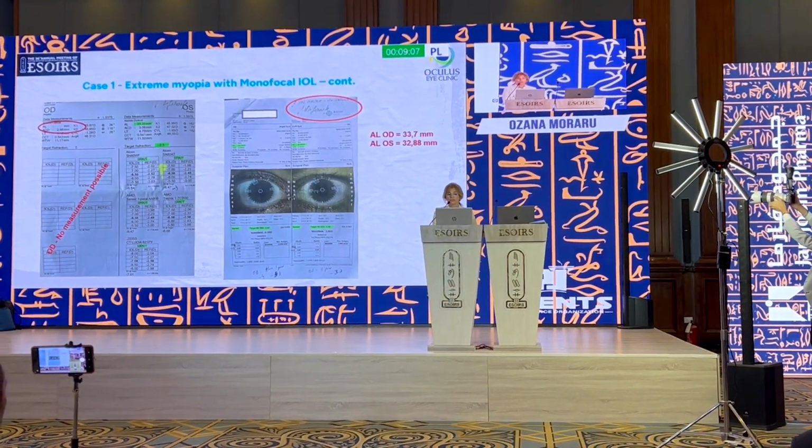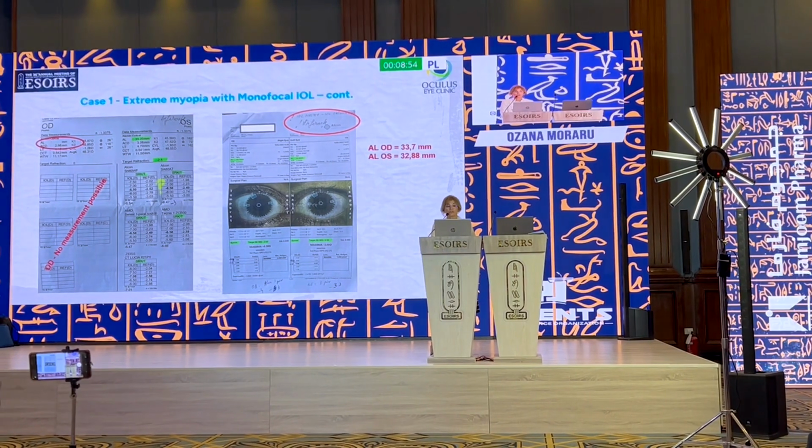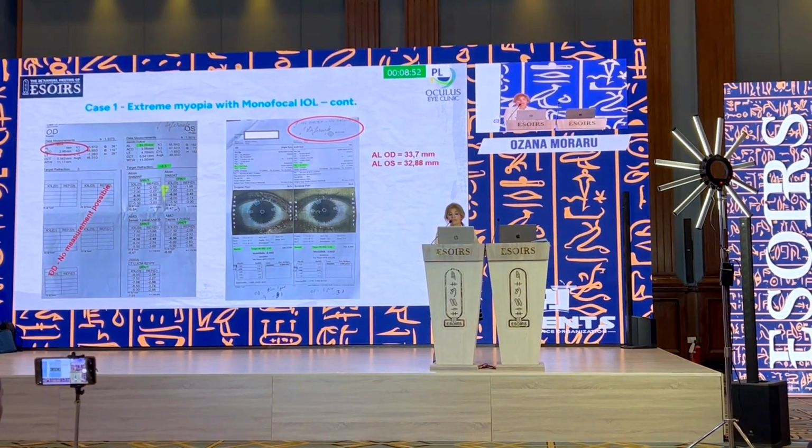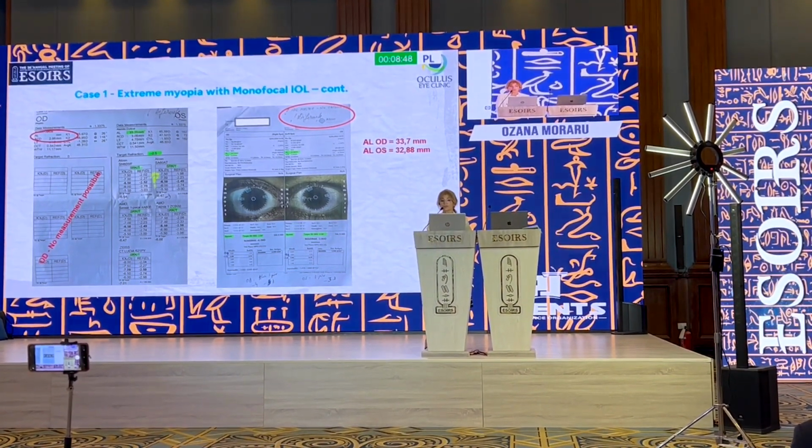The Topcon didn't measure the axis at all in the right eye, but the Argus did measure. In the left eye, we obtained measurements with both machines with some differences. As you see, in the Topcon the result was something about -7. With the Argus, the recommended result was something about -3 diopters.